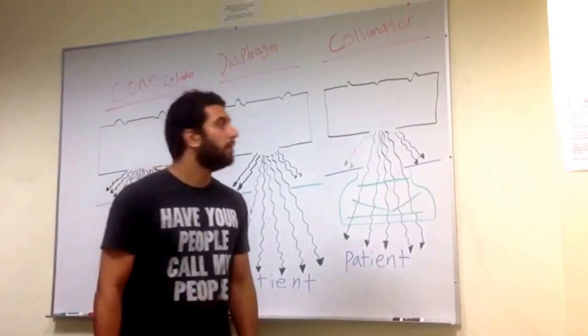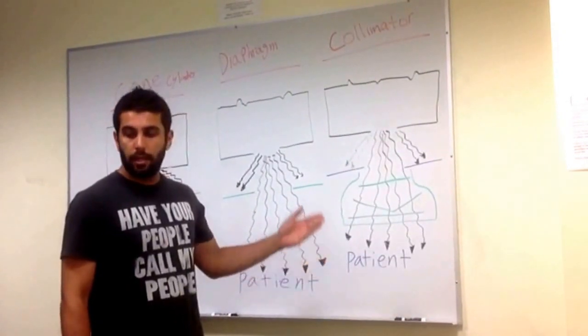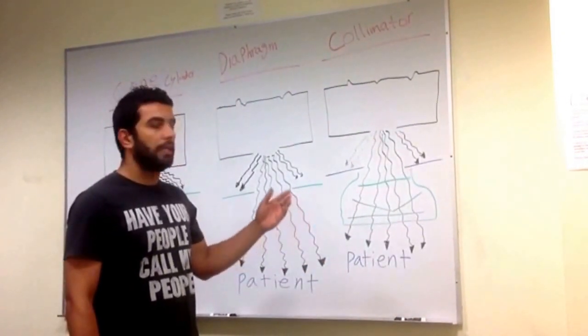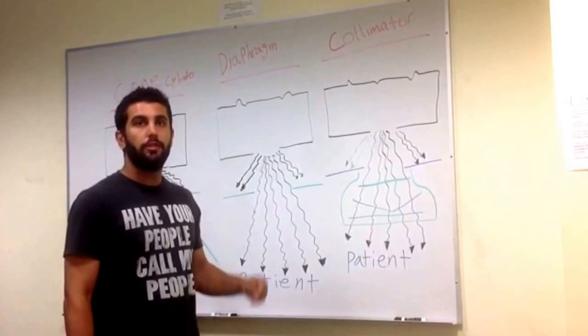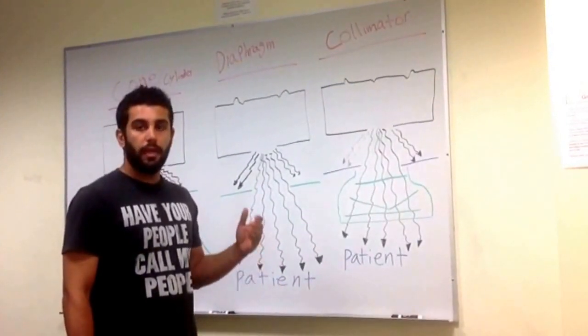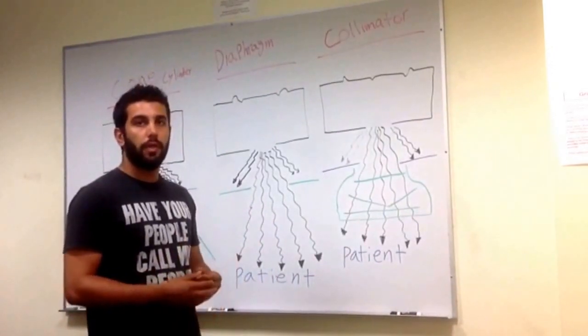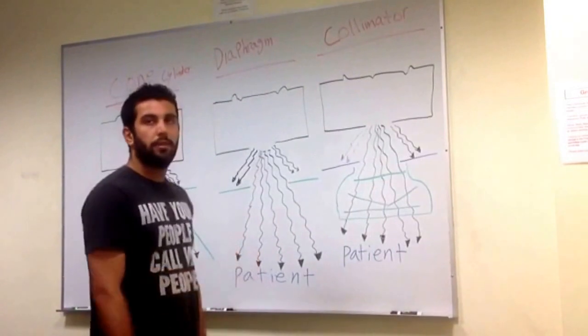The first part of the collimator works by controlling off-focus radiation, while an adjustable collimator is used for variable X-ray beam sizes, and by doing so we get the most efficient image from our X-rays.